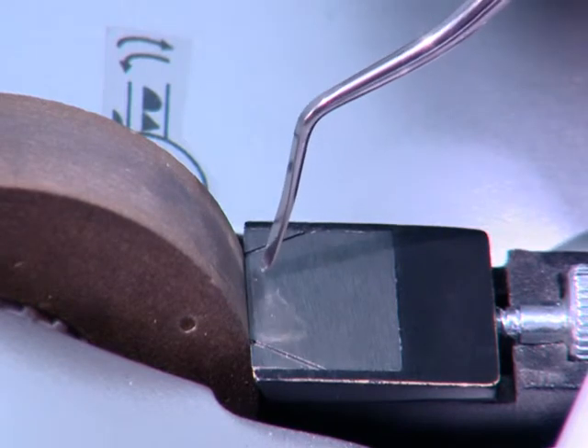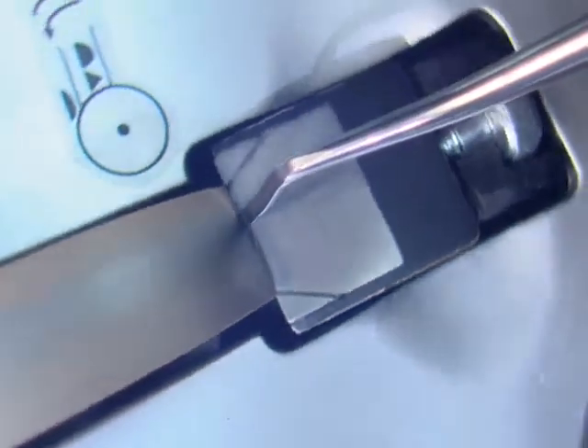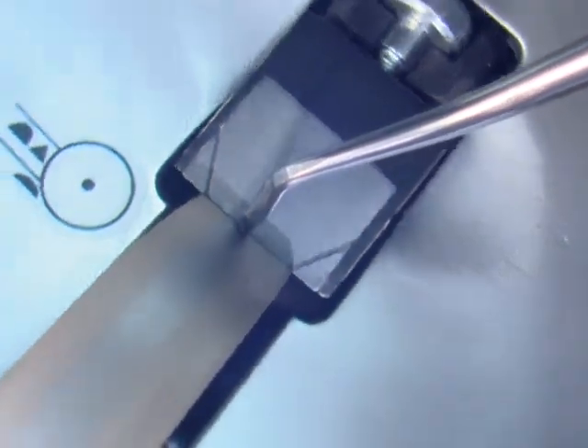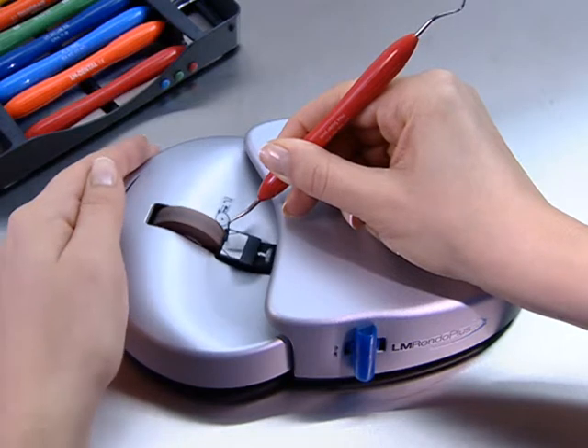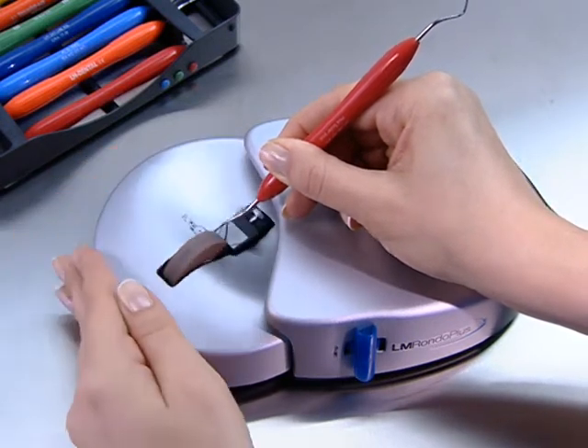Place the blade on the lower instrument rest with the face horizontal. Begin sharpening on one side of the blade and continue around the tip to the opposite side. Preserve the roundness of the blade angles. Follow this sharpening procedure for all hoe scalers.